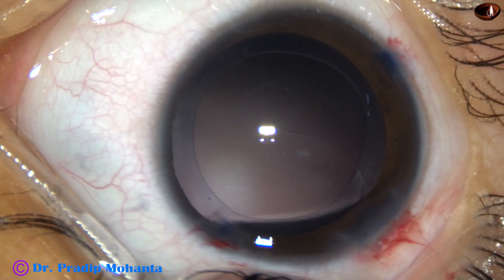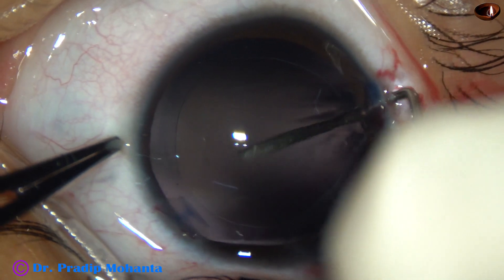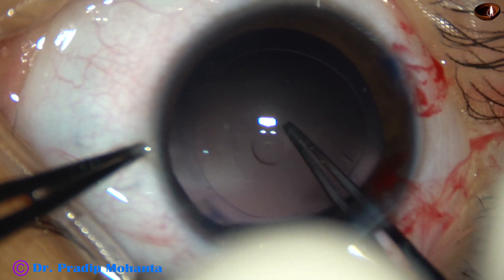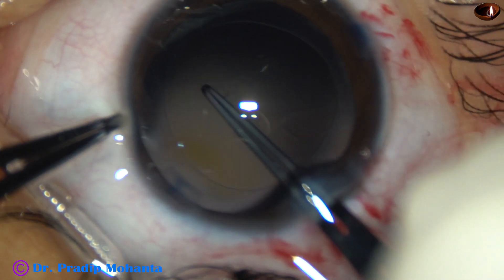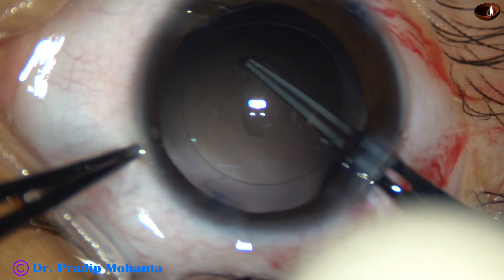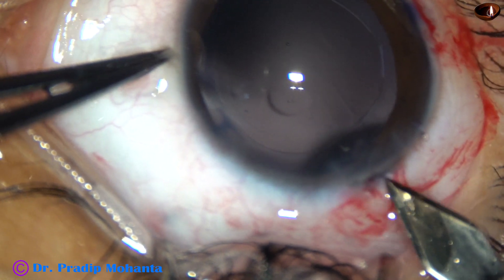In this case, in this 4-year-old child, I am going to do posterior CCC — posterior continuous curvilinear capsulorrhexis. Again I use the 26 gauge needle to raise the capsular tag and use the same utrata forceps, hold this capsular tag, and do a posterior continuous curvilinear capsulorrhexis. This rhexis should be smaller than the anterior rhexis. So we have to pull the capsule very judiciously. We have to create a balance between the centripetal force and the centrifugal force, and thus we get the optimum sized posterior CCC.